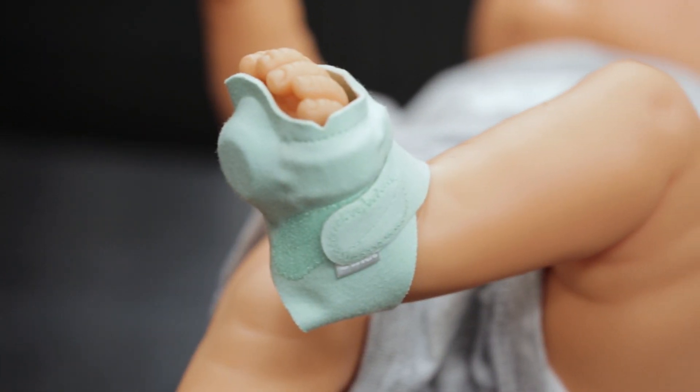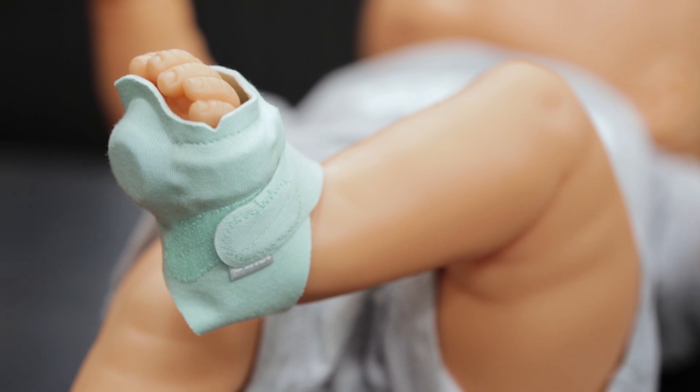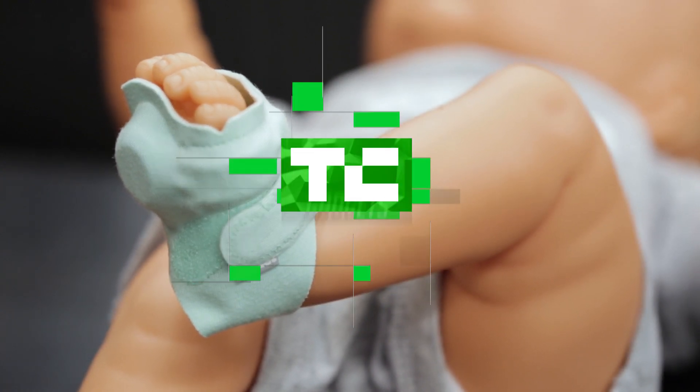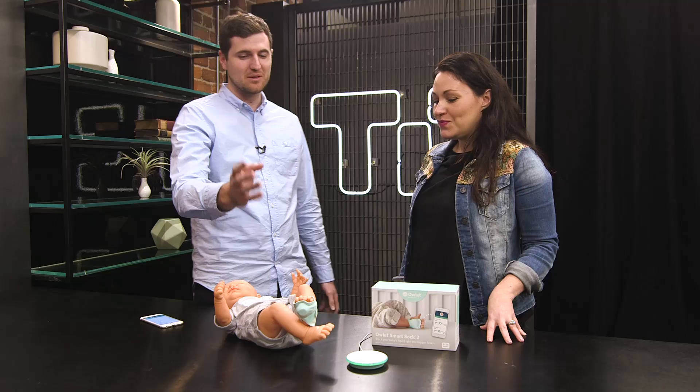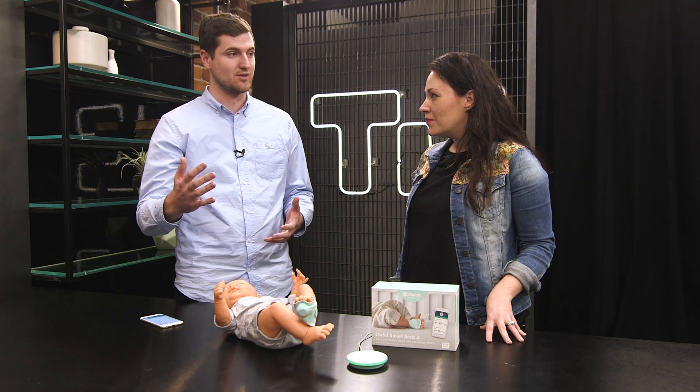What are we looking at here? I see a little sock wrapped around this baby doll. So what we're looking at here is the Owlet Smart Sock 2. It's a little baby sock that monitors your baby's heart rate and oxygen levels and can notify you if those levels go outside of the preset zone.